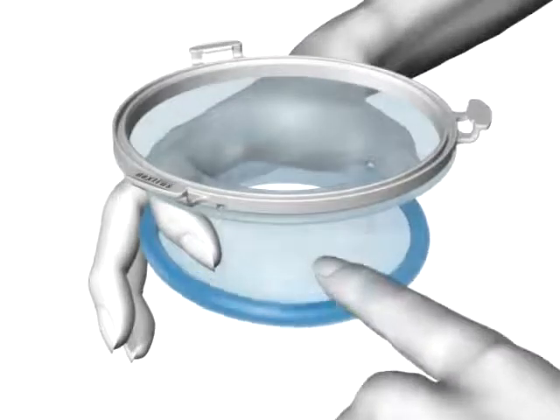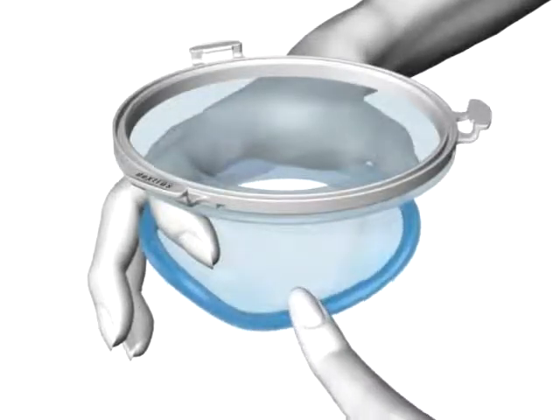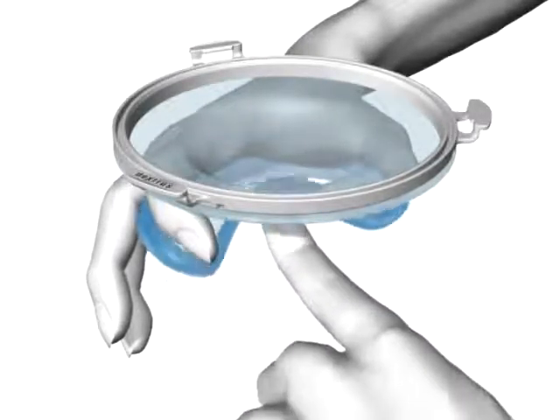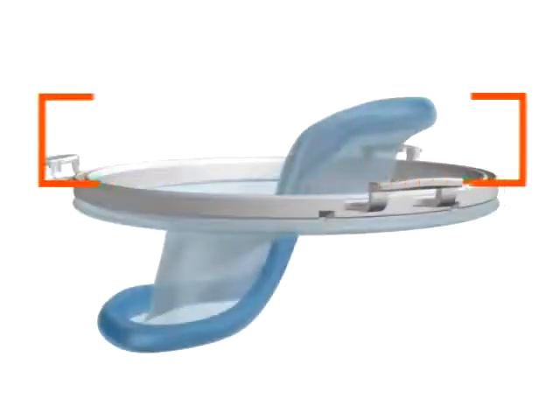With your other hand, push downward on the bottom flexible retractor ring, then push upward through the center aperture of the access retractor. Approximately one-third of the bottom retractor ring should be up through the center aperture and superior to the upper retractor ring.